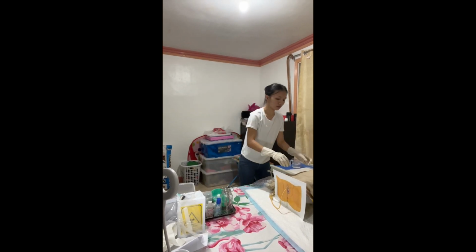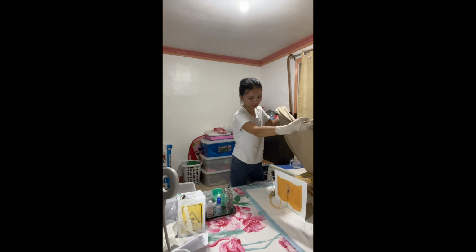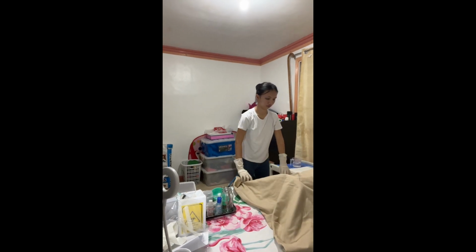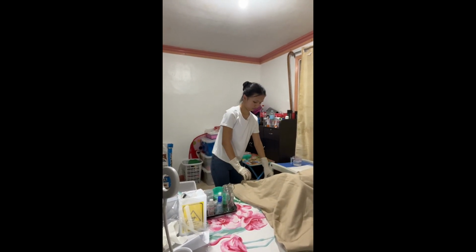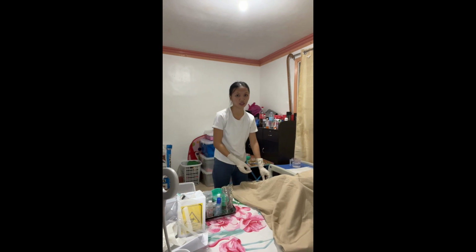Now, ma'am, I am going to cover you up with this blanket. We are going to ensure that the bag is under the bed of the patient or at the side of the patient.